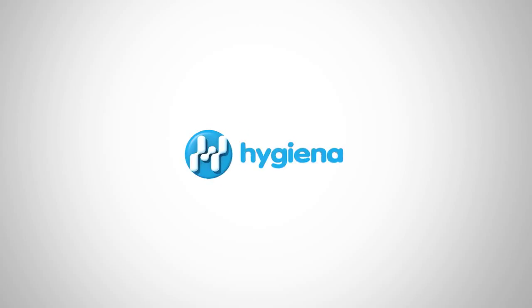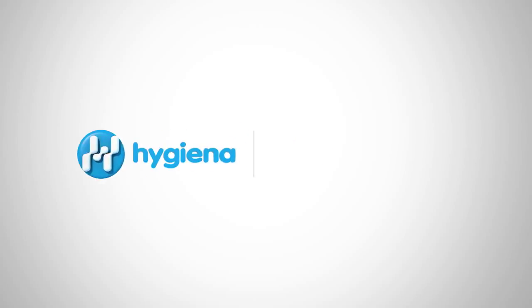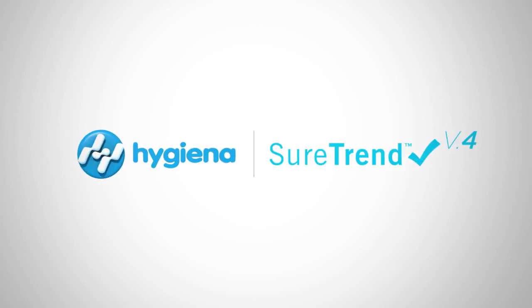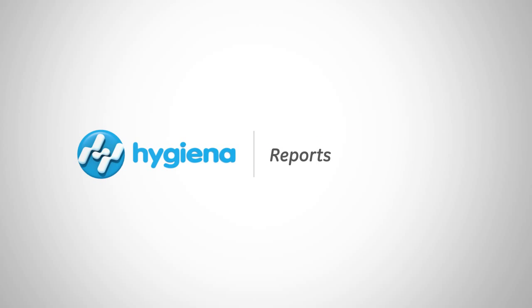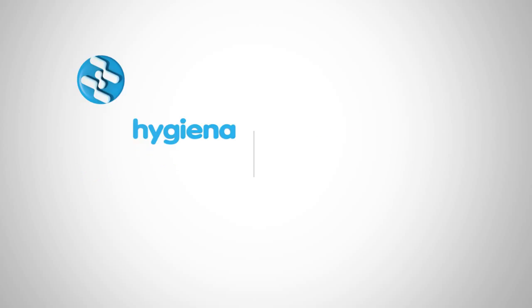Welcome to the SureTrend 4 instructional video series for healthcare. In this video, we'll cover running reports. Let's get started.